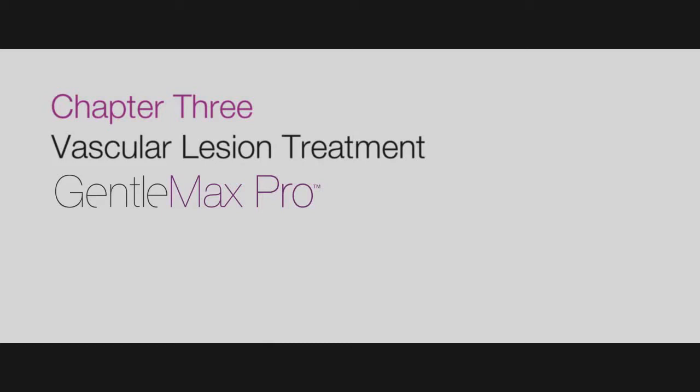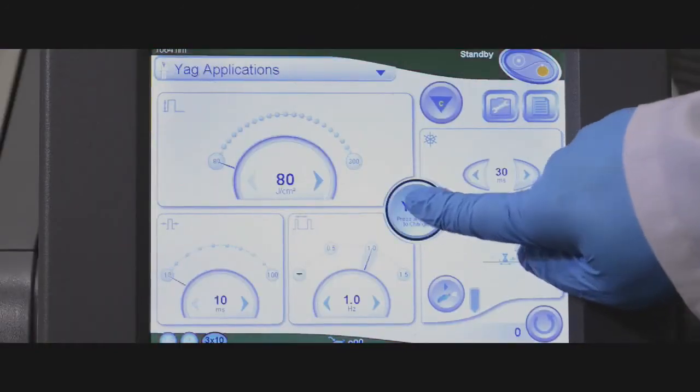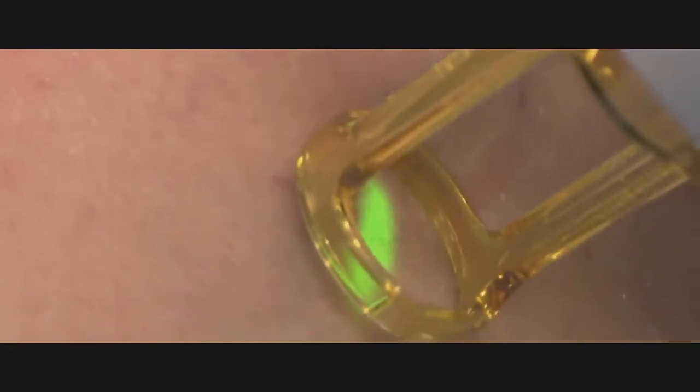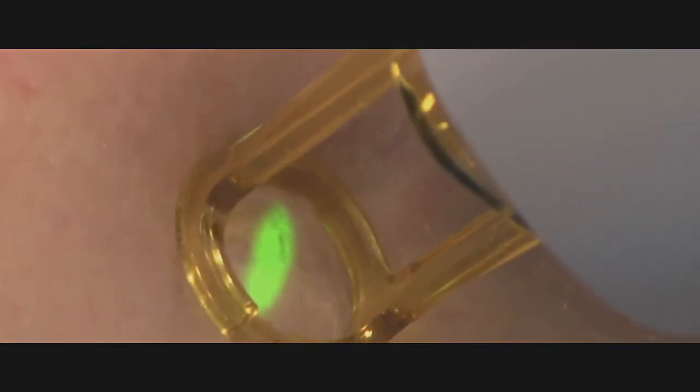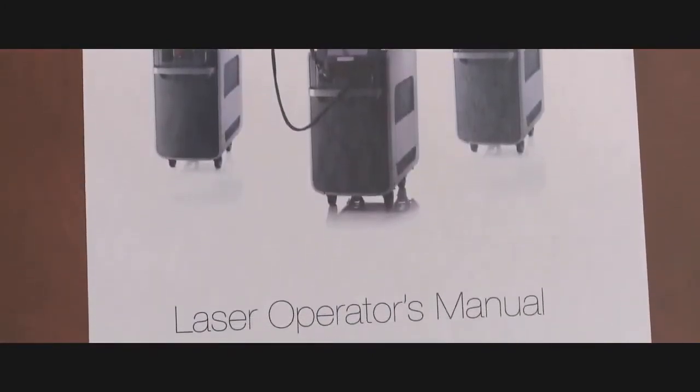Chapter 3. Vascular Lesion Treatment. Vascular lesion treatments can be accomplished with the 755 nanometer wavelength and the 1064 nanometer wavelength. See the clinical manual for a complete explanation of indications and suggested settings.